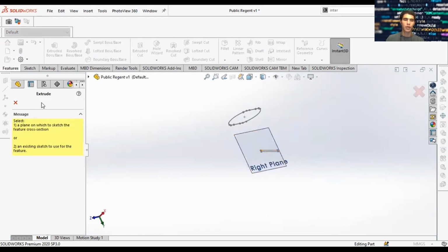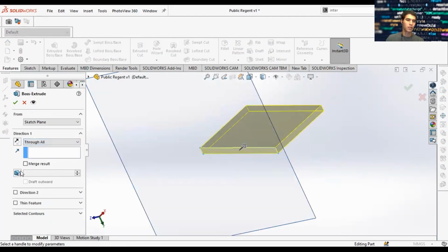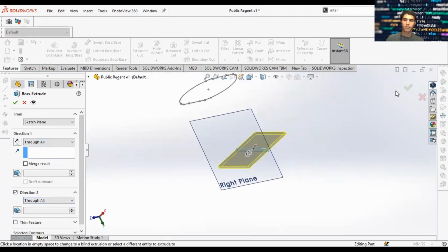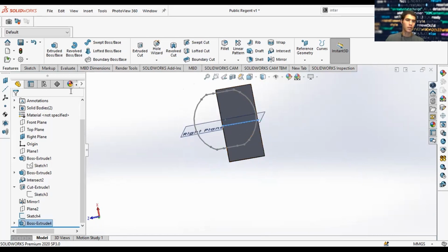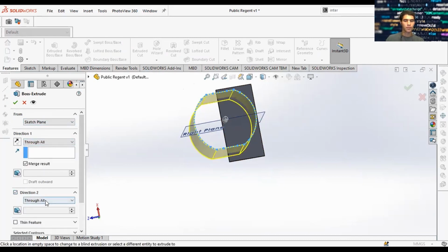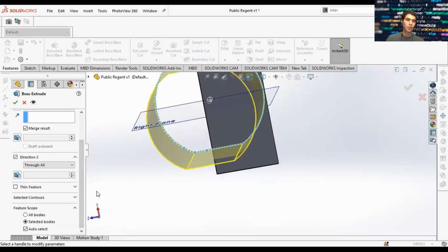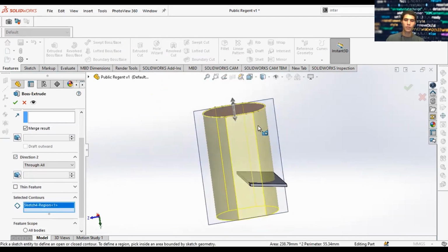Features. Let's go ahead and extrude boss base this leaflet we made. Sketch number 5, extrude boss base. And we'll do it on both sides. And we'll go up here to our sketch number 4, and we'll extrude boss base that sketch through all. We don't particularly want the thin part of it, we just want the inside part of it. So that should give us this result.